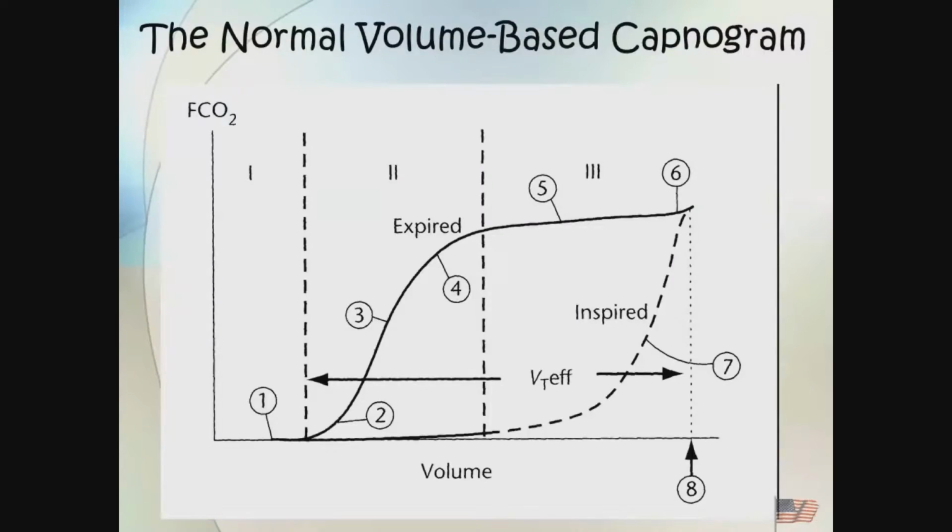I'm making the assumption that predominantly, any exposure you've had to capnography has been time-based capnography, where you're measuring tidal CO2 versus time. Your typical one we covered last time, those slides. Yeah? Volumetric capnography is a whole different beast. And in actuality, I think it's probably a better use of the technology than the traditional one.